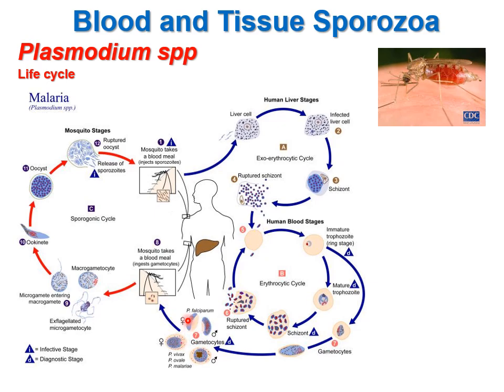these differences, but I want to draw your attention that for Plasmodium falciparum, gametocytes are crescentic, whereas for the 3 others, vivax, ovale, and malariae, they have an oval shape, and we cannot distinguish them upon seeing them under a microscope in a blood smear. So for the 3 species, vivax, ovale, and malariae, we have to look for other characteristics in order to identify them in a blood smear.